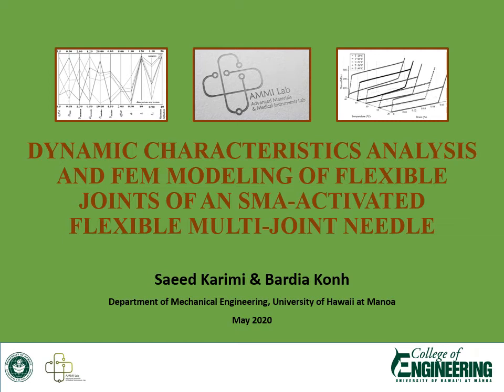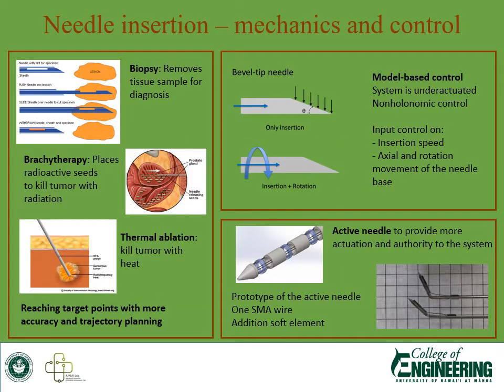Hello, I am Bardia Konh, and I am presenting dynamic characteristics analysis and FEM modeling of flexible joints of an activated flexible multi-joint needle. This slide shows a little background about needle insertion methods.